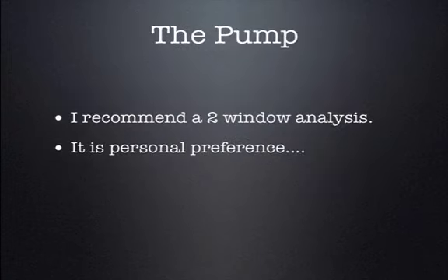Now, with evaluating the pump, there's multiple windows to accomplish this. I recommend a 2-window analysis. Which windows you use is ultimately your personal preference. I'll just tell you now how I play it.